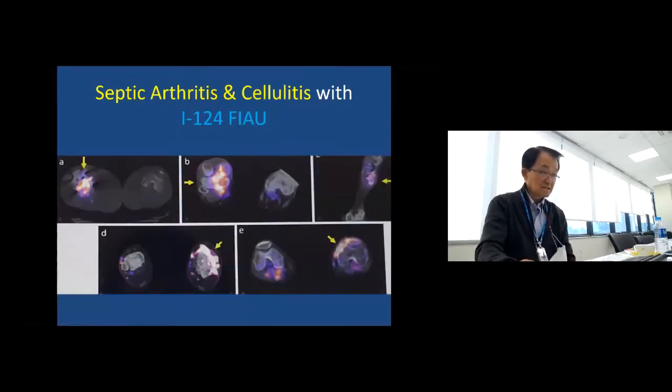And certain septic arthritis, it's not easy to diagnose by conventional MR, CT, or nuclear bone scan. And this kind of nucleoside, directly looking maybe at DNA synthesis of this inflammatory process. It's easy to show.